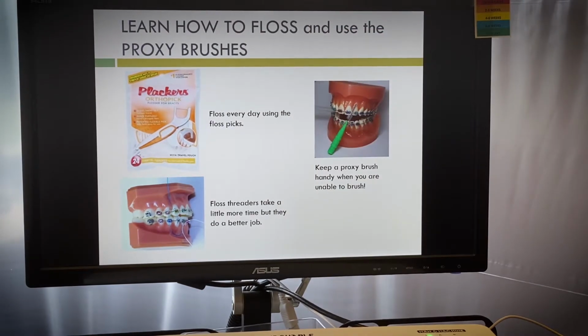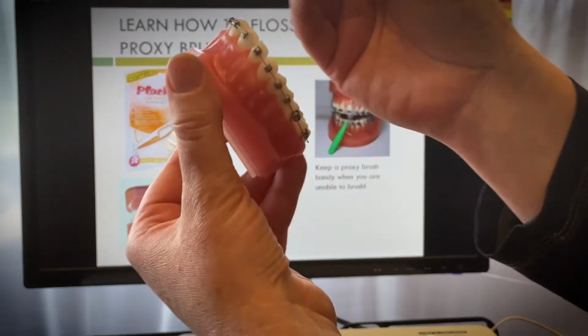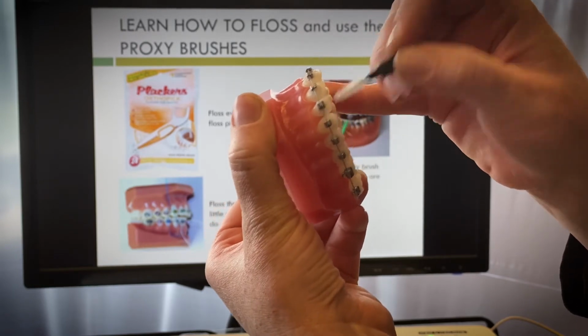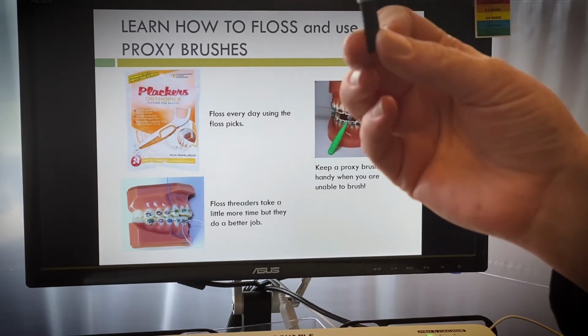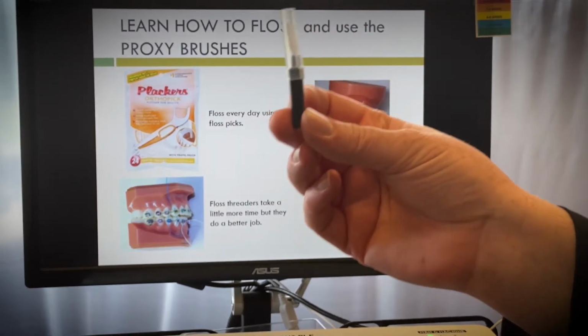Also, we have these little proxy brushes. It's this little Christmas tree shaped brush, and they are just made to fit right underneath the wire and in between the brackets to keep everything nice and clean. You can just take that right like that, and also it has a little lid to it so you can take it on the go to help keep things clean when you're out and about and away from the house, okay?